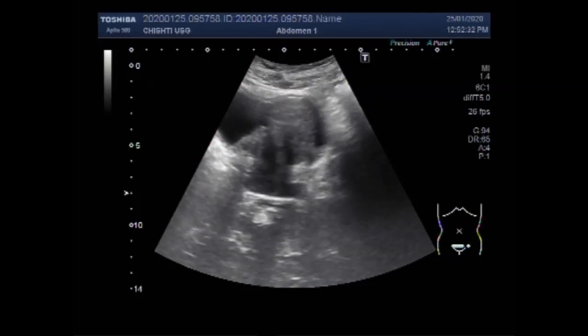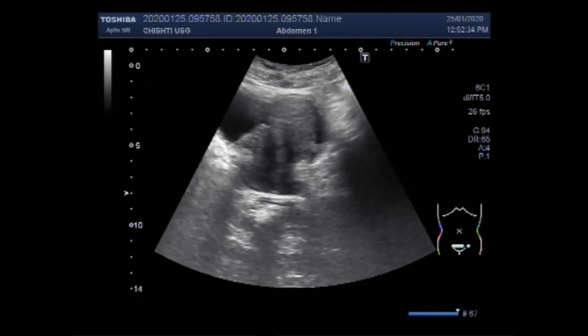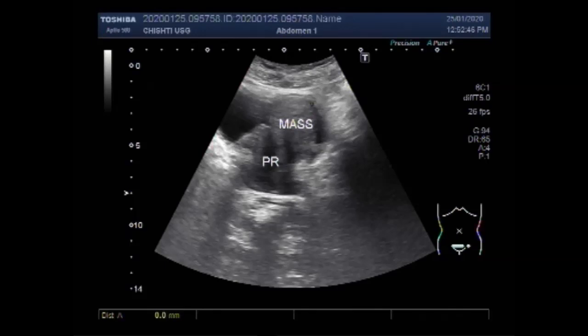Now you can see a mass in the upper portion of the prostate, along the anterior wall of the prostate. This mass is round to oval in shape, semi-solid to solid in consistency, and it measures about 36.5 x 35.2 mm.